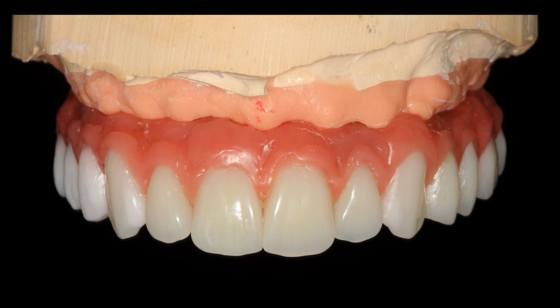In a case like this gentleman's, we ordered denture teeth, which already have beautiful contours, so we're not having to recreate those by hand in wax. We set those on the model in wax over the red bar that I showed you a few slides ago, and this allows us to do a try-in, and we call this the prototype. It's what we're suggesting to the patient that we do in the final restoration.